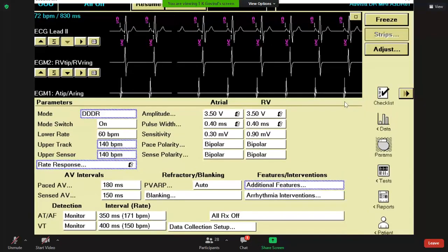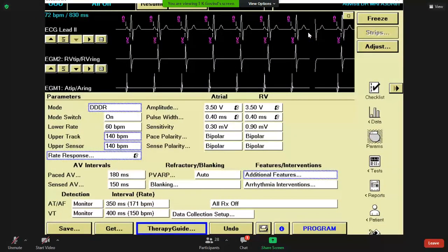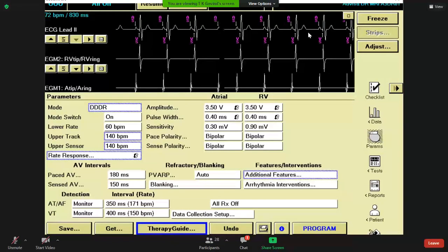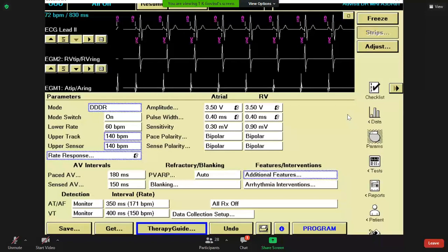The patient will get the symptom also the AFib. So I think when the patient is in atrial fibrillation, he will get palpitation. When it goes to DDI mode, the rate also decreases. So there is some problem they could, I think.